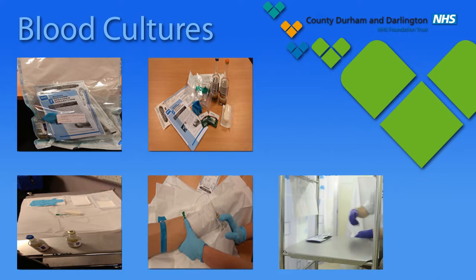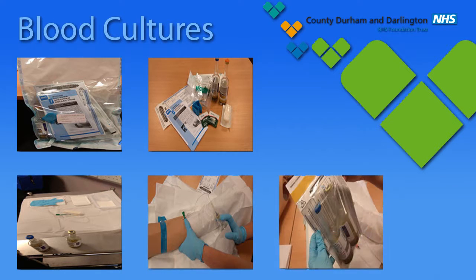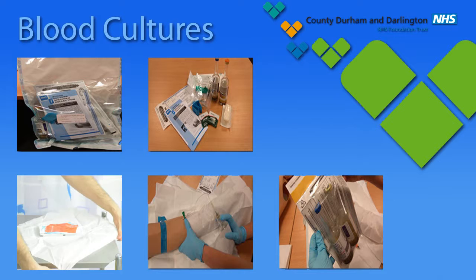Hello. Part of the process for identifying sepsis is to culture the organism which is causing an infection in your patient. The best diagnostic tool is to take blood cultures. This video is to raise awareness of doing this procedure correctly and highlights the importance of performing the procedure aseptically when taking blood cultures in order to be able to identify patients who have a bacterial infection.